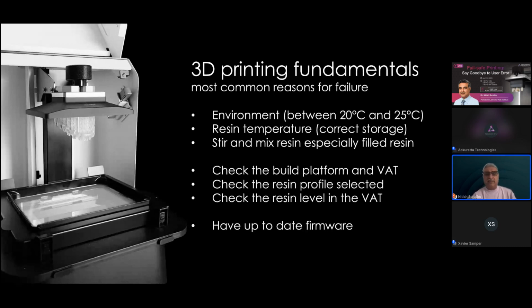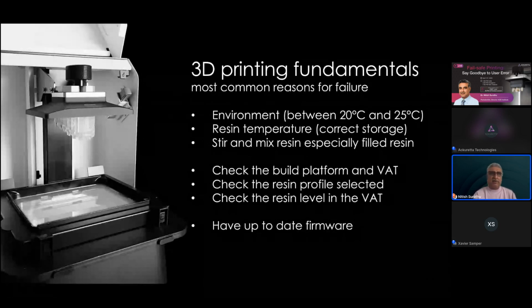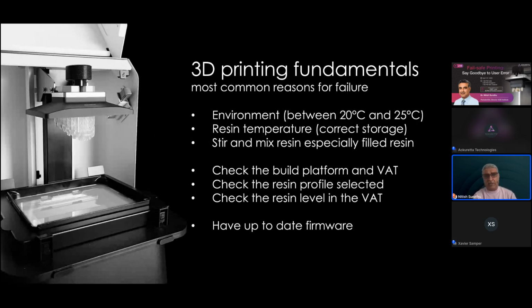But let's start with looking at some of these factors. Printers don't like cold temperatures. Printers also don't like very hot temperatures. And while I live in a part of the world that seems to have a very nice temperature range, I'm well aware that that's not the situation everywhere in the world. Printers like to live in a room that is temperature controlled, and printers like to live in a room where the humidity is low. So a dry room somewhere between 20 to 25 degrees is a great place for your printer to be. Anything colder than that, and it starts to present some challenges for some materials in particular.